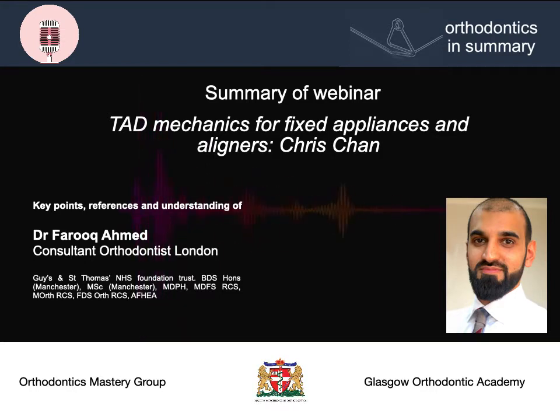Today we're looking at Chris Chan's lecture at the AAO entitled TAD Mechanics for Fixed Appliances and Aligners. Now Chris started off describing how aligners work, and they work by being a push appliance.